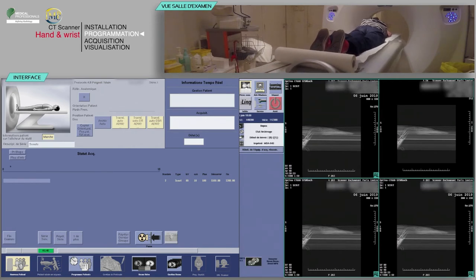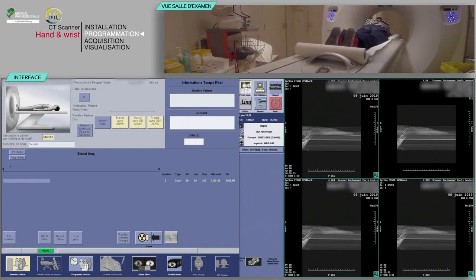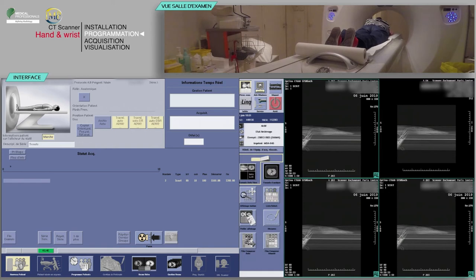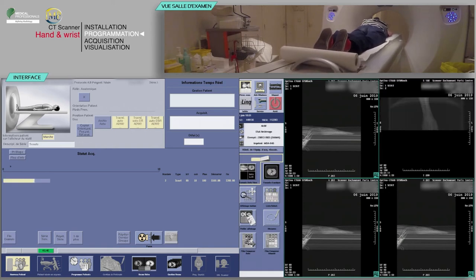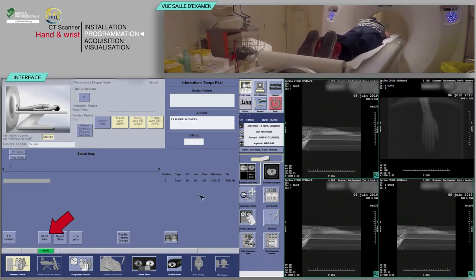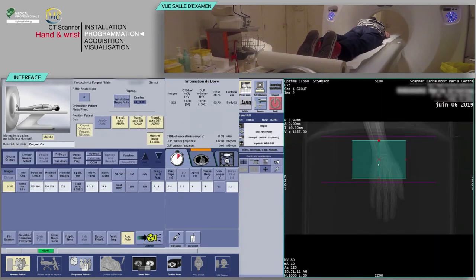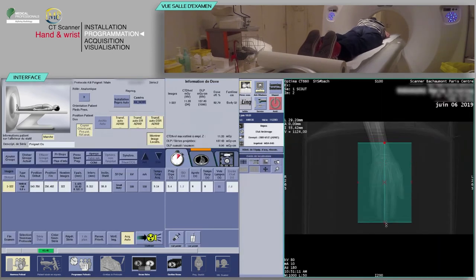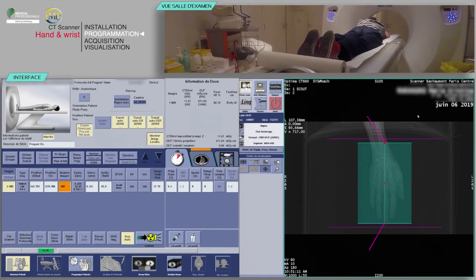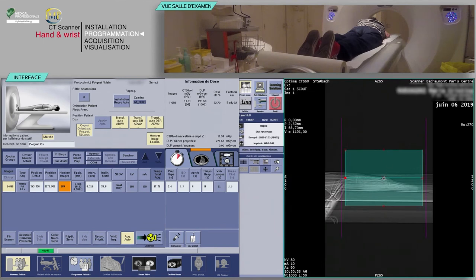Repeat to obtain the lateral view. Click Next Series. Place your slice box on the AP localizer in such a way as to cover the hand and wrist from the lower third of the radius and ulna to the soft tissues of the middle finger. Then check that the entire segment is covered on the lateral scout view.